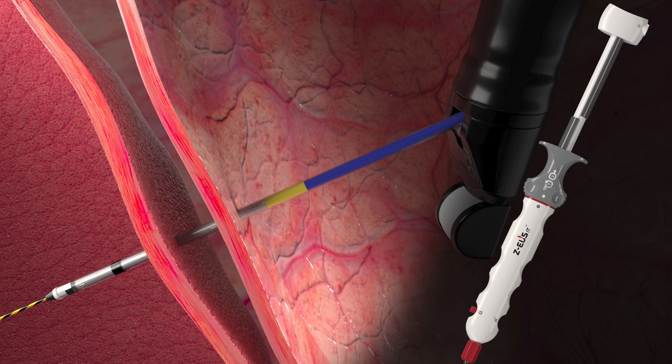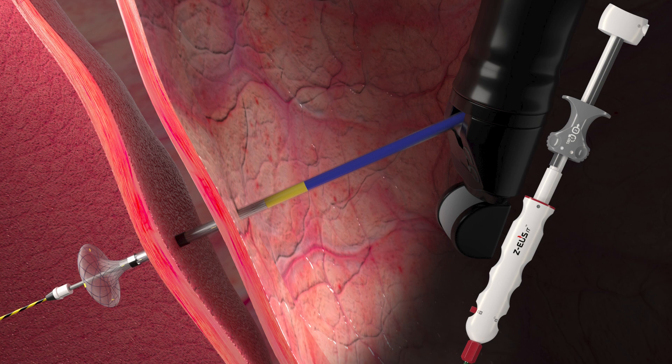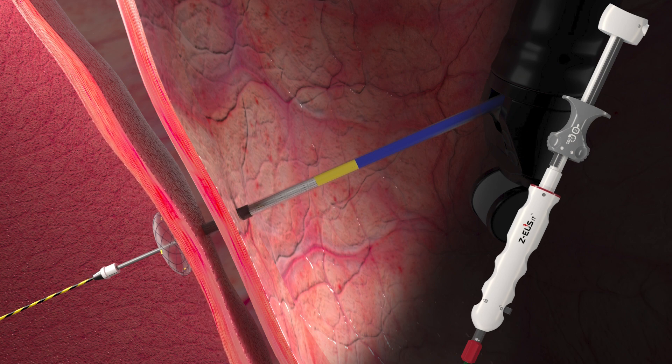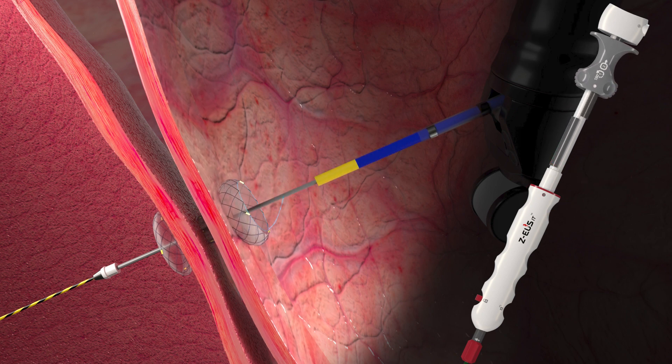Step 2: Stent deployment. To deploy the distal flange, rotate the spin lock 180 degrees. Deployment is ready when you see odd numbers of stent deployment indicators. Push it upwards until you feel a click. Pull the endoscope back slightly to the wall. Make sure the black marker is visible under the endoscopic view. If the black marker is not visible, unlock the sheath lock and slide the sheath handle 2 to 3 mm upwards until the black marker is fully visible, then lock the sheath lock. To deploy the proximal flange, rotate the spin lock 180 degrees again. Deployment is ready when you see even numbers of stent deployment indicators. Push it all the way upwards.